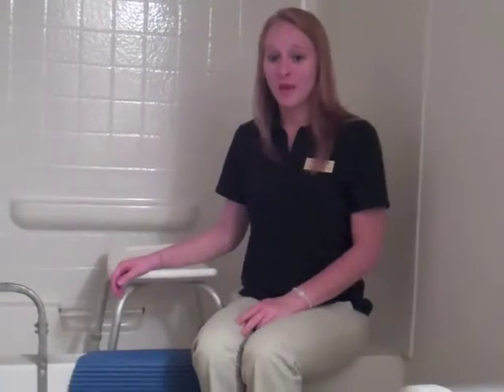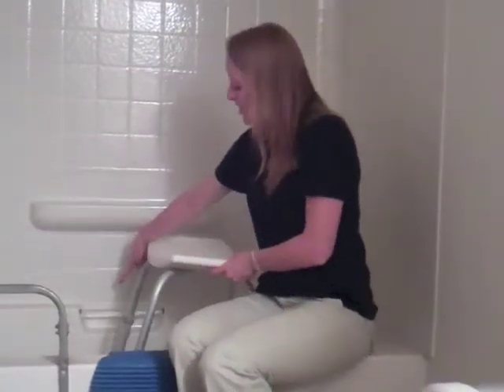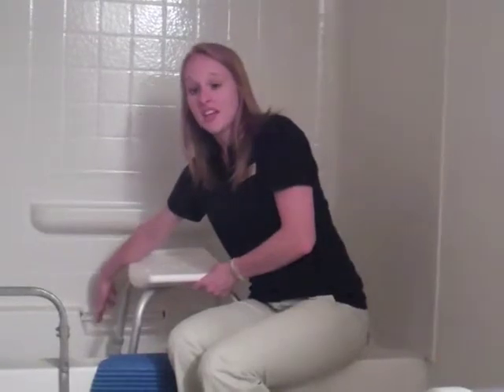Getting in and out of the bathtub can be very risky. Slick surfaces can lead to increased risk for falling. There are many pieces of adaptive equipment that can be used to reduce this risk. One of them is grab bars. Grab bars can be put on the side of the tub like this. There's also a grab bar down here on the inside of the tub, and grab bars are often also put up on the walls in a bathroom to allow for something for a patient to grab onto for steadiness.